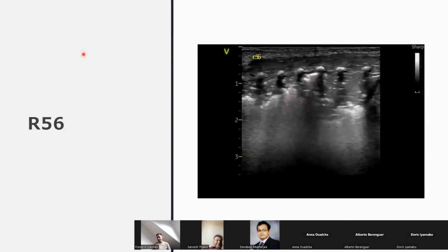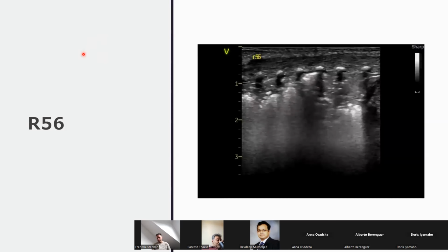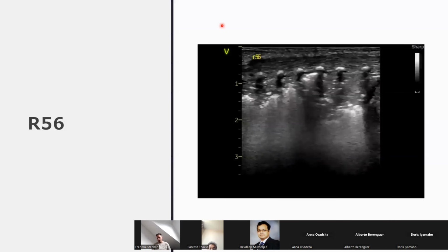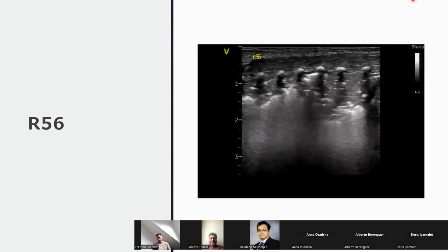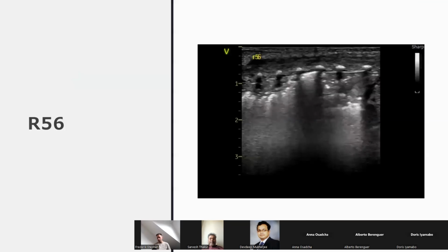Okay, great. My only comment is, have we seen the left side? No, not yet. So we need a comprehensive scan, quite crucially, because the left side might have an air leak. Just being a little bit pedantic here to say that always, if you're doing and planning any recruitment maneuvers, always do comprehensive scans. And I'll explain why. But let's have a look at the left side now.